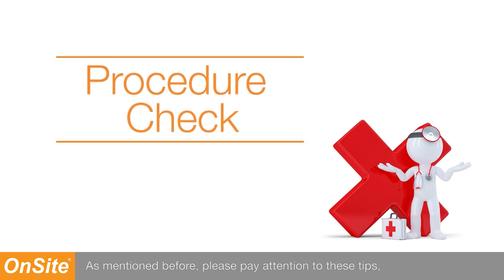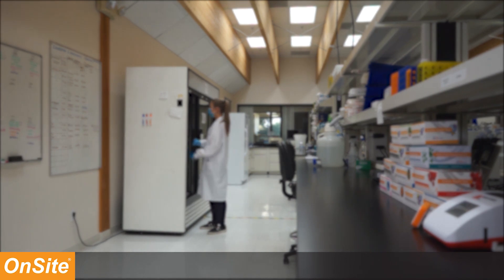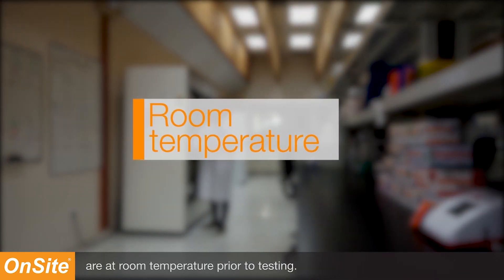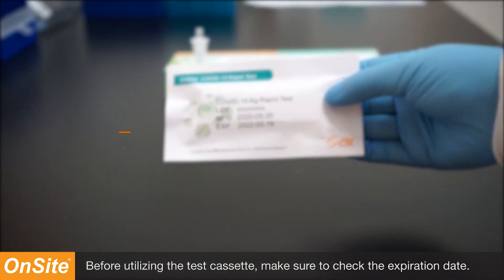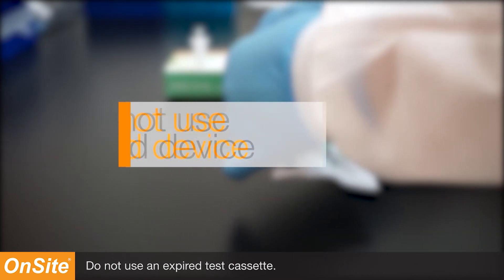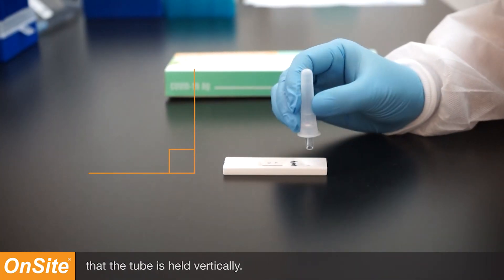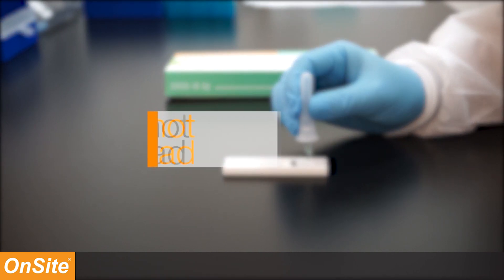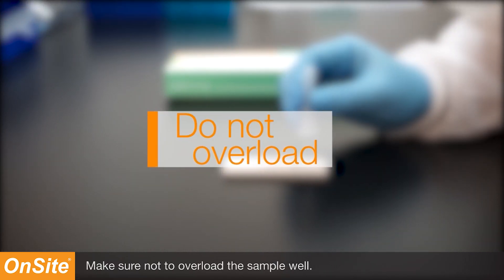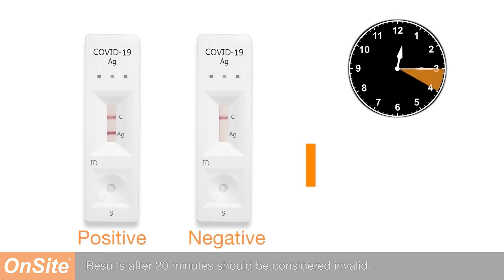Please pay attention to these tips to ensure proper procedure. Make sure the test cassettes and components are at room temperature prior to testing. Before utilizing the test cassette, make sure to check the expiration date — do not use an expired test cassette. Make sure that when dispensing the extracted sample, the tube is held vertically. Make sure not to overload the sample well. Read the results after 15 minutes but before 20 minutes; results after 20 minutes should be considered invalid.